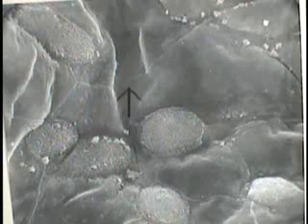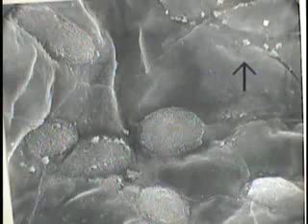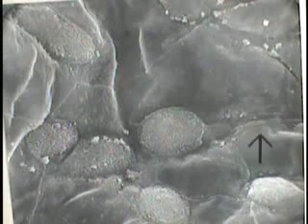So this flat, smooth area now being crossed by the arrow is the cytoplasmic or the plasma lemma of a type 1 alveolocyte. Another junction is showing here where it joins another type 1 immediately adjacent to it.